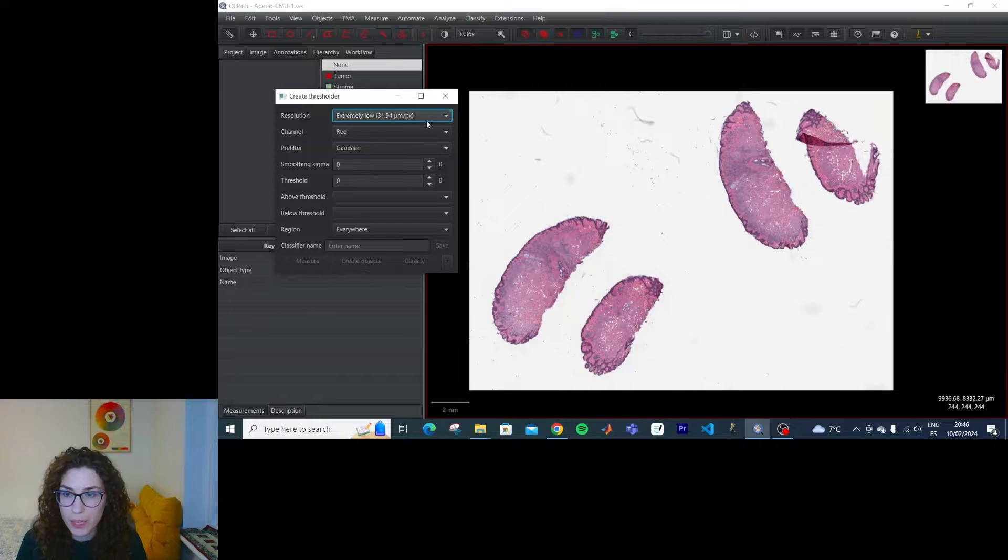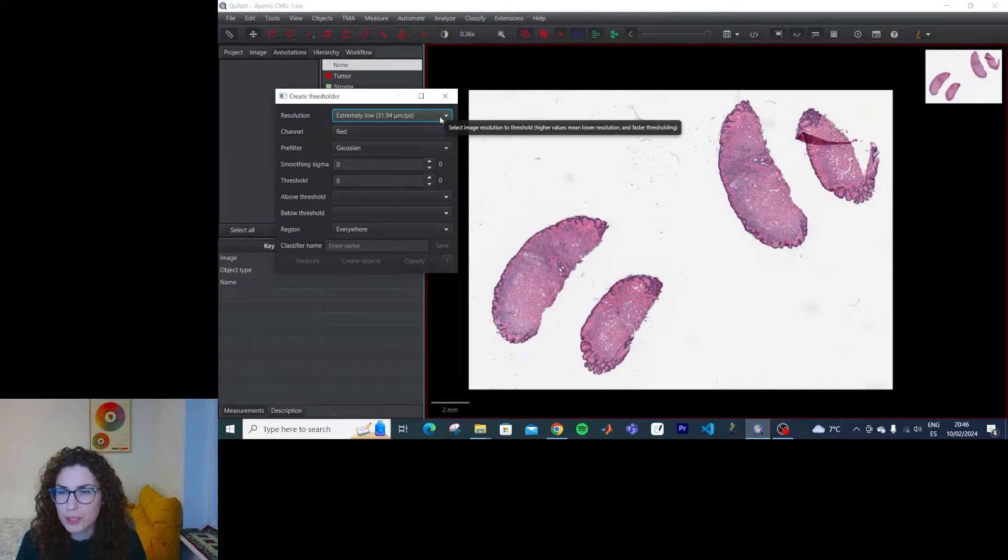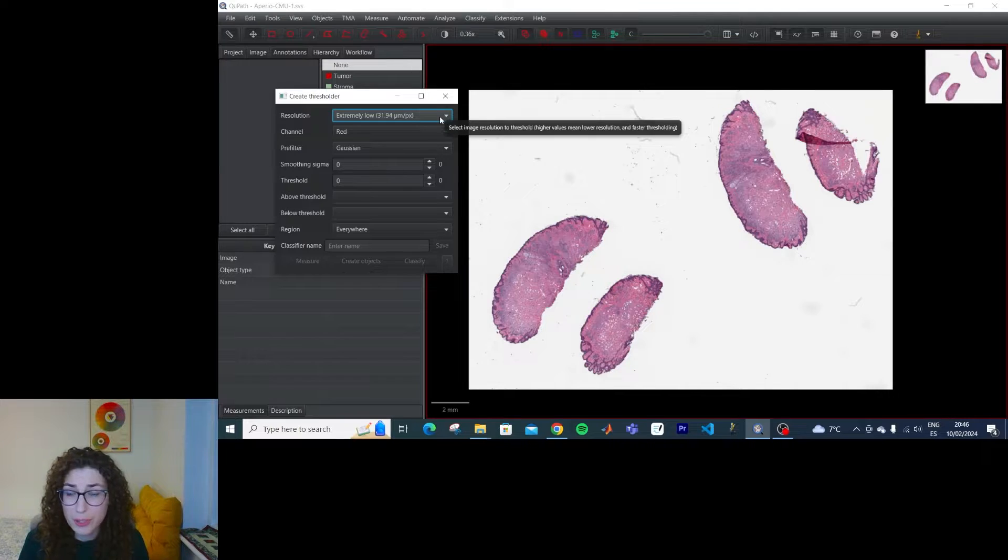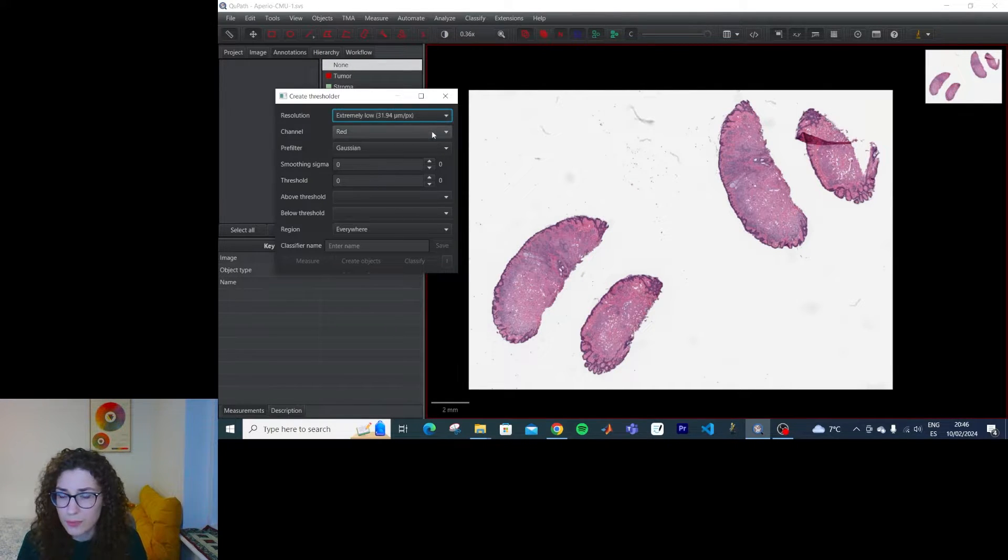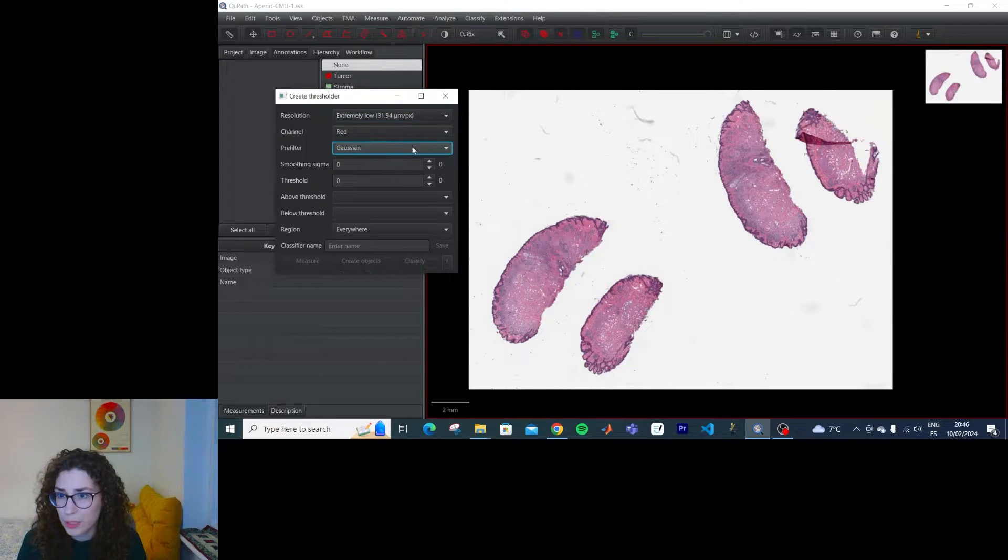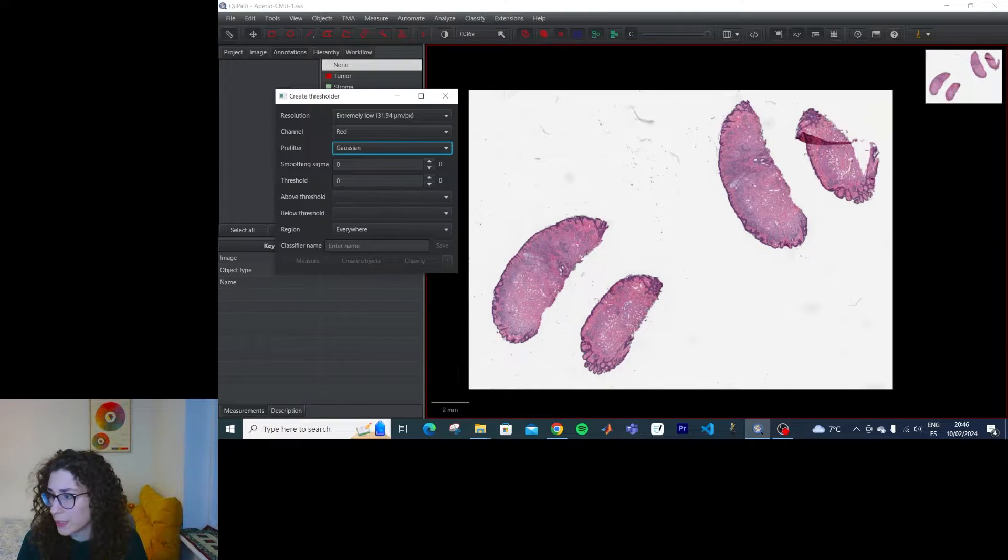And here we get the resolution we want to do this on. So I guess that the higher the resolution, the slower it will be, but obviously the more detailed. A channel we want to use for the thresholding, if we want to do some filtering, and yeah, the classification.